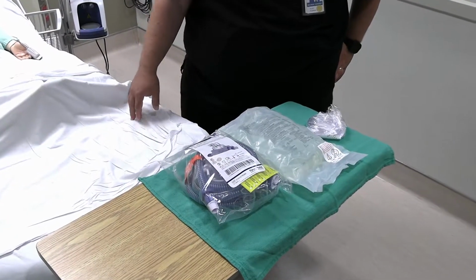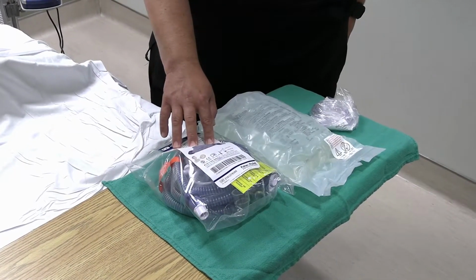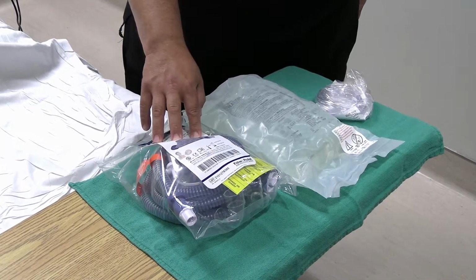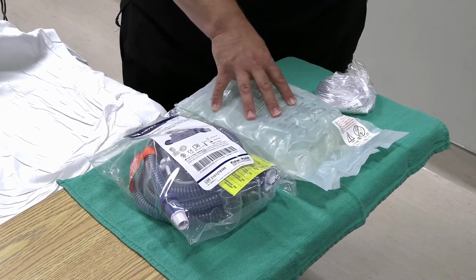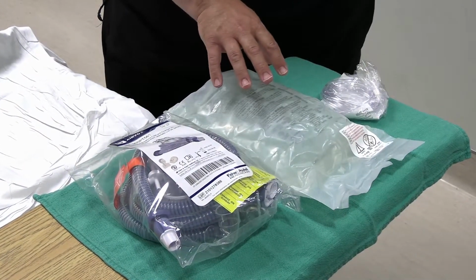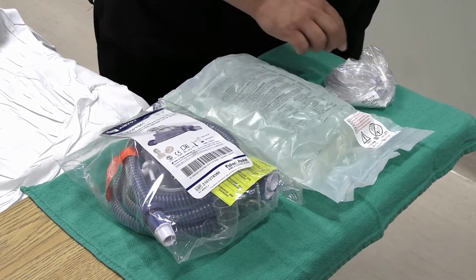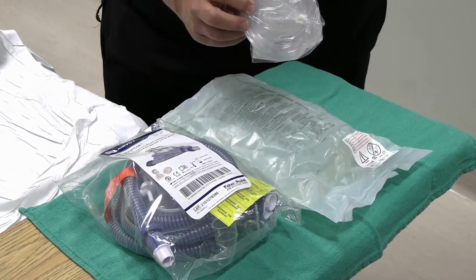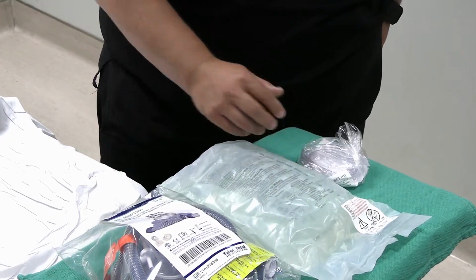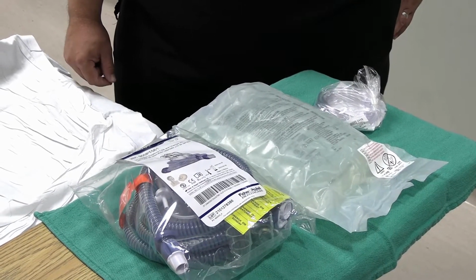Now we're preparing the AIRVO with the consumables to build our patient circuit. So we have our universal high flow circuit here. It has a heated wire circuit in addition to a water chamber that will attach our sterile water for inhalation. So depending on your organization, you may have a 1 or 2 liter bag. This is a 2 liter bag of sterile water for inhalation. And in addition to that, you are going to need oxygen tubing, so your 7-foot oxygen tubing to attach to your flow meter and to your AIRVO device in order to deliver oxygen to your patient.